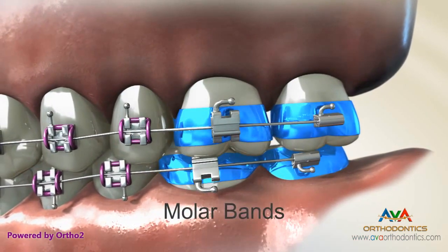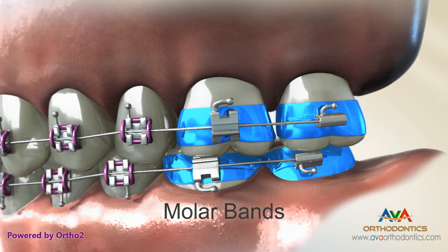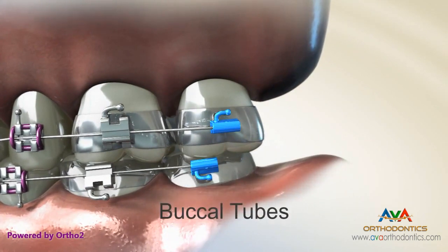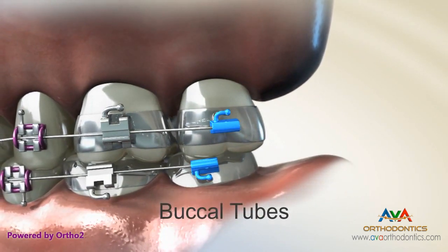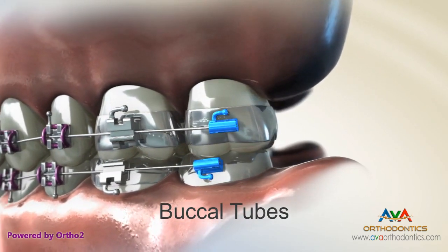Molar bands encircle the molar and can be used to provide excellent anchorage for brackets that are then welded or attached to the band itself. The buccal tube can appear in a number of different configurations and provides mounting options for appliances, headgear, and other orthodontic auxiliary devices.